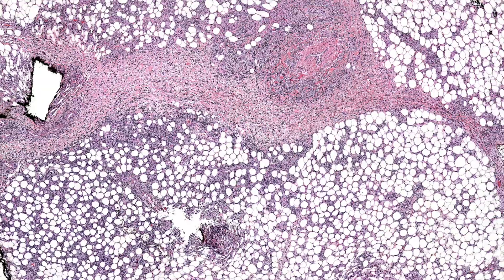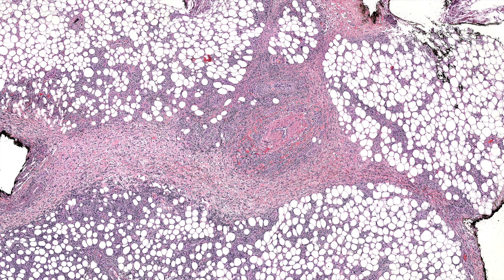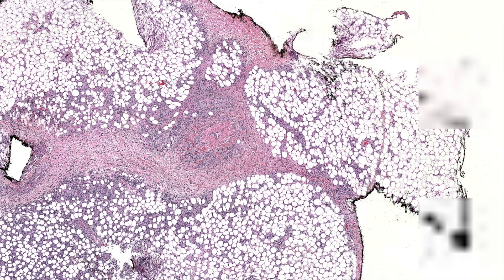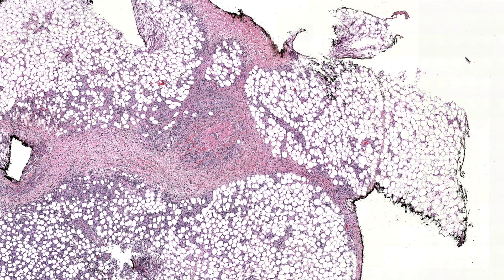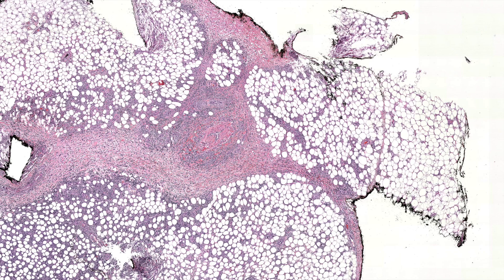I actually got to interview Tony Subtil — that interview is on the American Society of Dermatopathology YouTube channel. I asked him how to sort alpha-beta from gamma-delta, and his answer was that gamma-delta usually involves all levels of the skin: the subcutis, the dermis, and often the epidermis with epidermotropism, whereas alpha-beta paniculitis is usually just in the subcutis. In a case like this where we only have fat, it won't help us, but gamma-delta often has overlying skin involvement whereas alpha-beta doesn't. With immunostains and the help of experienced hematopathology colleagues, hopefully we can sort it out because there is a significant difference in prognosis.